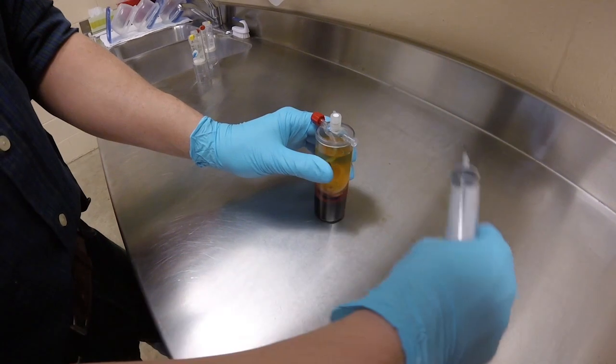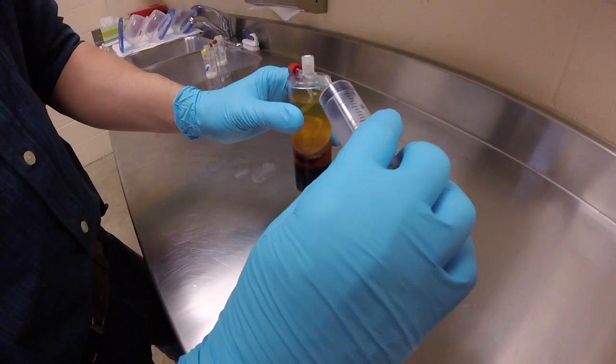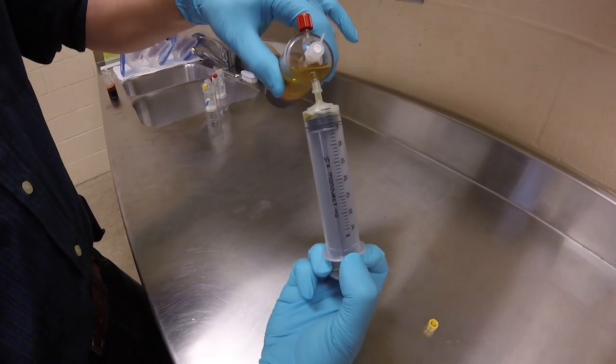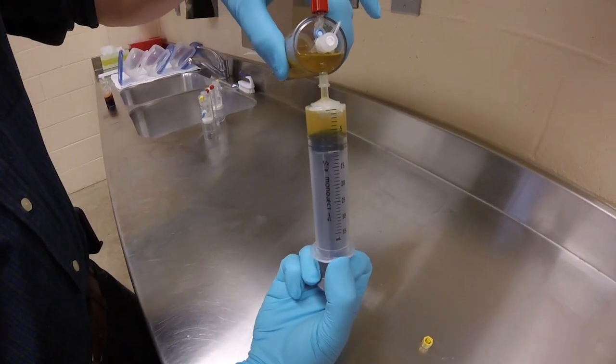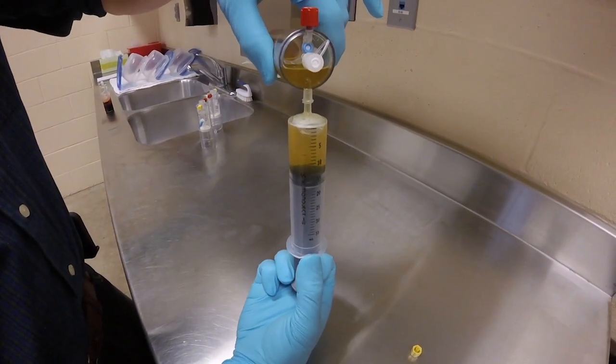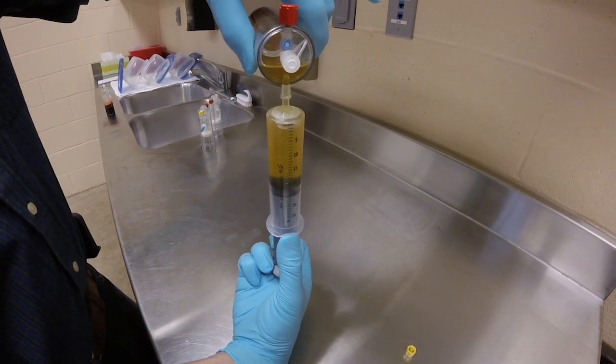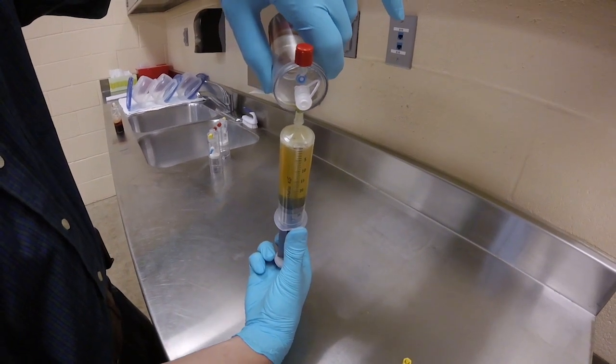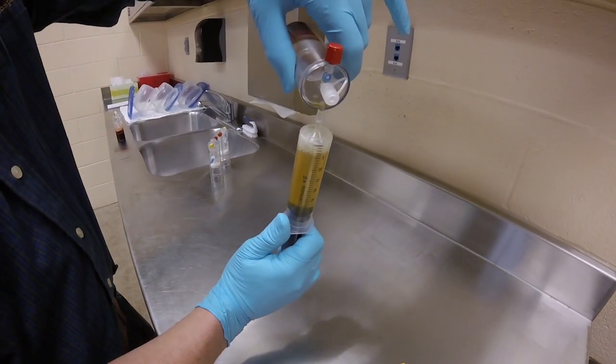When removing the platelet poor plasma, tilt at an angle but avoid inverting, keeping the fluid below the top blue vent. When complete, replace the yellow cap on the device. The platelet poor plasma that has been removed can be discarded.